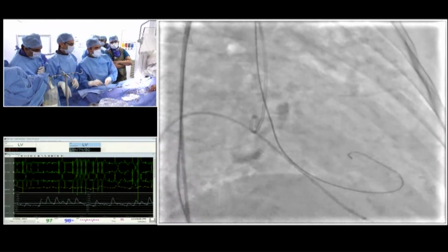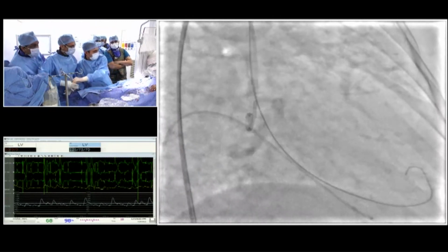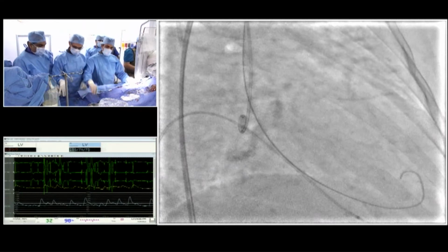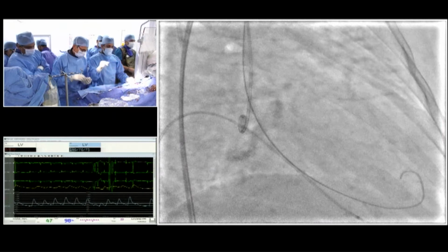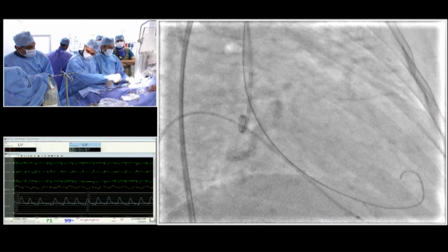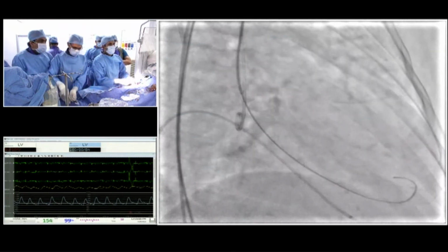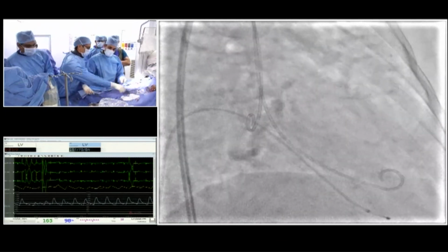Yeah, we do it routinely. Part of my issue is it's an accessory device, and one important component is that the device has been shown to be very safe. And it does capture debris. But you raise the point, it's a cost issue. Is there clinical benefit? This fall we'll have the data from PROTECTED TAVR, which will hopefully help answer some of the clinical question of stroke reduction. But my attitude has been, if it's safe, I'd rather capture the debris. I agree it's not an ideal device, and we don't have ideal data. There'll be other devices coming down the road. Hopefully we'll get better data, but I think stroke is one of the most important things, so we've got to try to continue to reduce that rate.